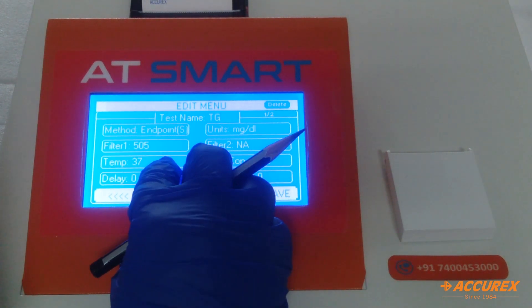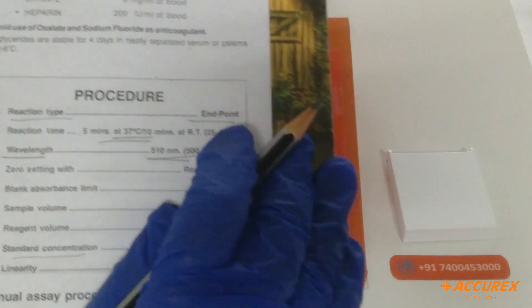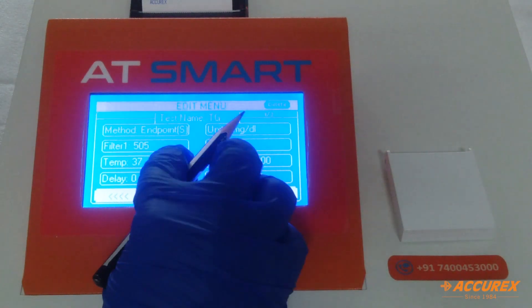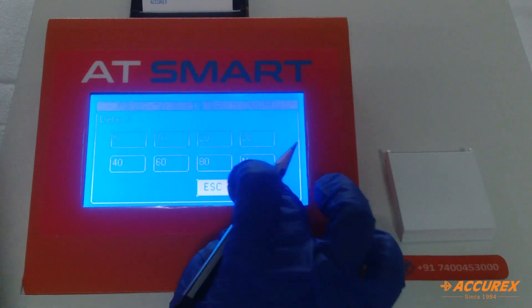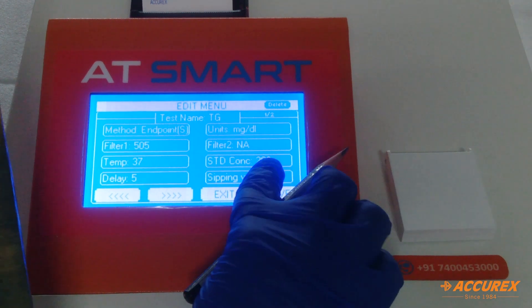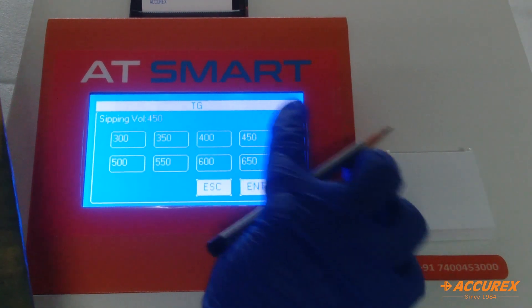For delay time — because it is endpoint — press 5 and enter. For sipping volume, press 450 and enter.